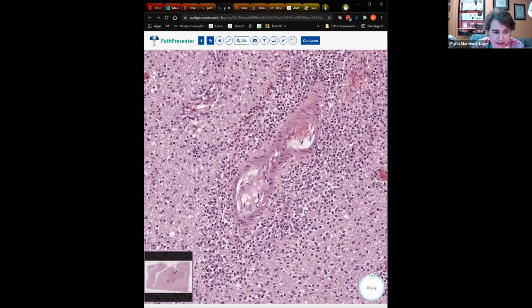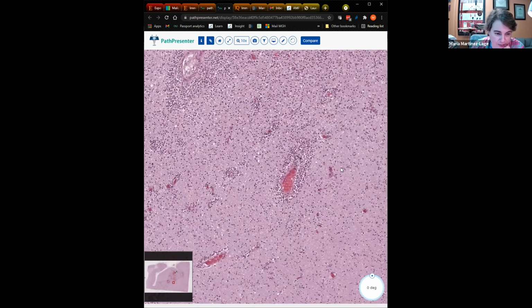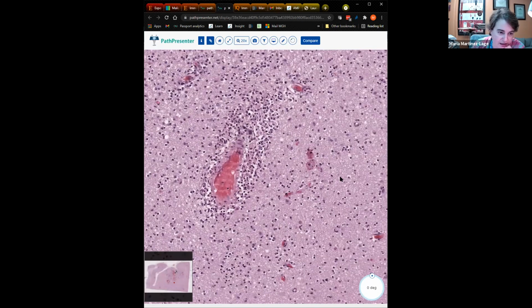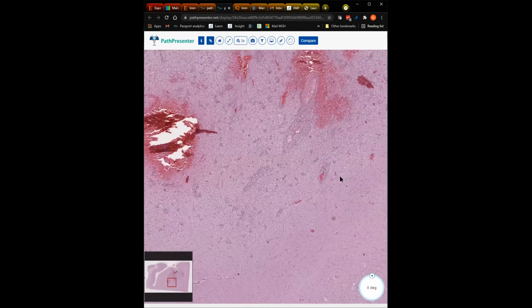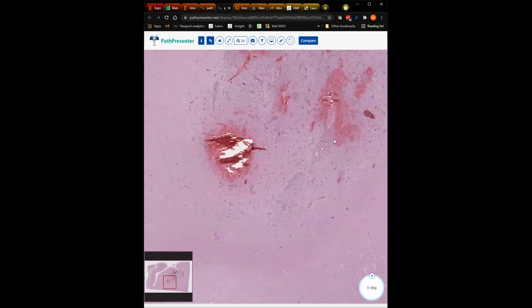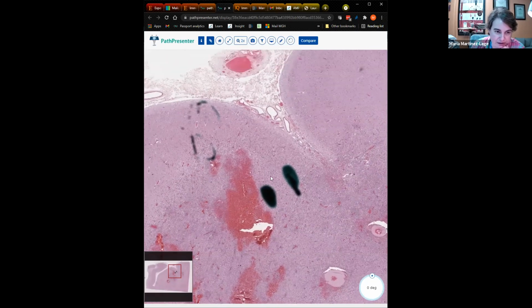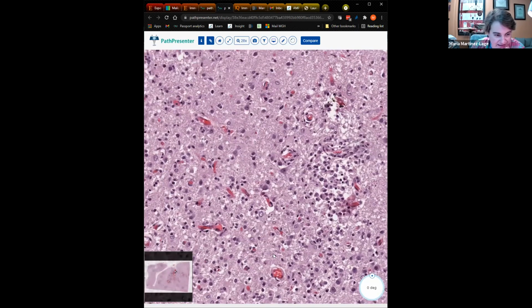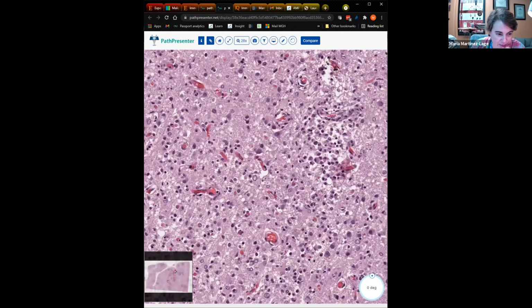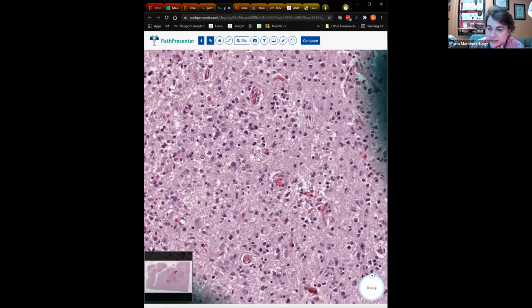If you have neutrophils that are scattered in the neuropil, we call that cerebritis. But of course, when they become a solid nest of neutrophils, that's abscess formation. And then what we're going to be looking for is, are there organisms that we can actually identify on H&E? These days we have a very useful immunohistochemical stain.